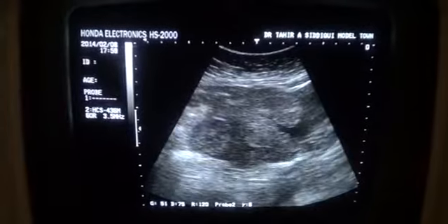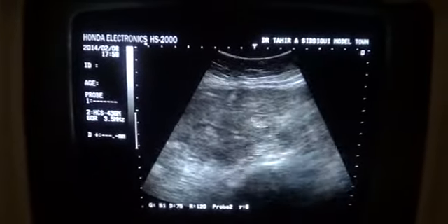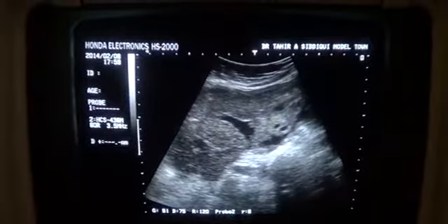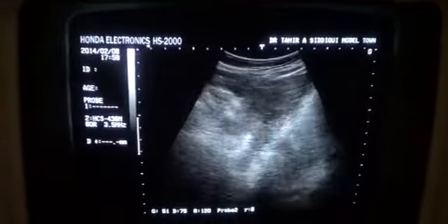This is an echogenic area. This is an echogenic area. This is an echogenic area with fluid floating among the fluids. See these echogenic areas where internals have internal cystic areas as well.